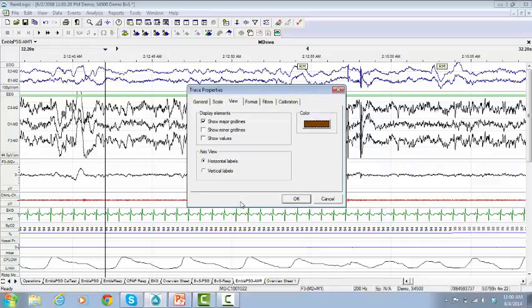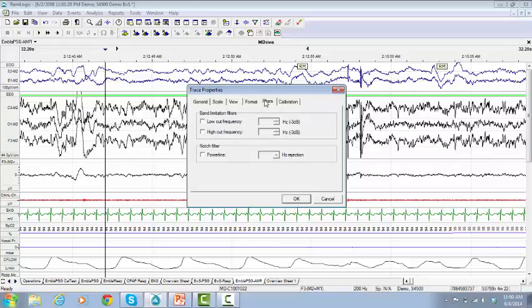Go to the tab Filters. Type the required values in order to change the filter settings if needed. Click OK.